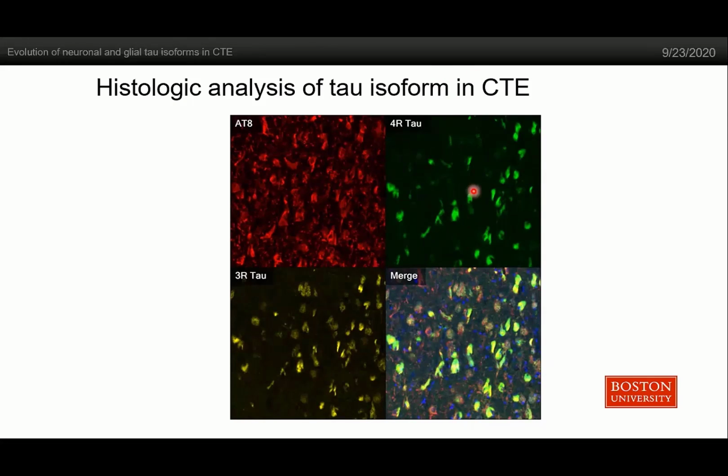This was all done by hand by me originally, but we are working on techniques that are allowing for automated counting of this. One of the downfalls of working in neural tissue is you have a lot of irregular shaped cells. So neurons, astrocytes, microglia, they don't really follow a set pattern. You can see it here, you have all of these positive neurons that are all quite different, so it's hard to get automated methods to count them. The original analysis here was all going to be done by hand counting, but we're working with AI right now to better quantitate these so I don't have to spend hours at my desk counting and can do more productive things.